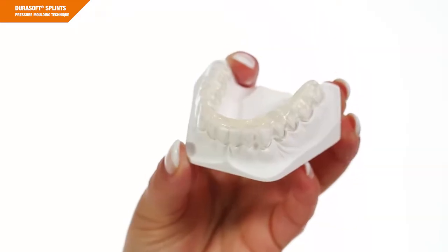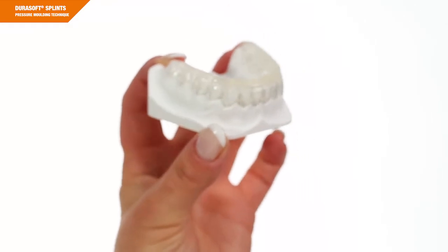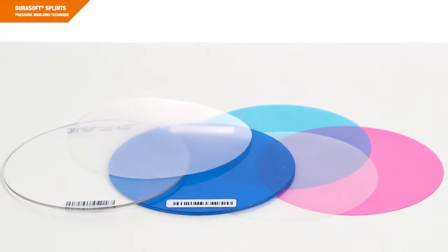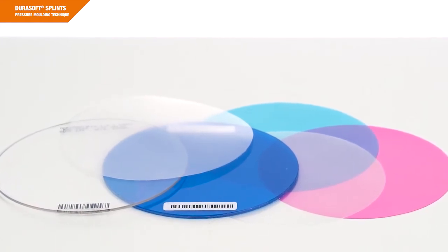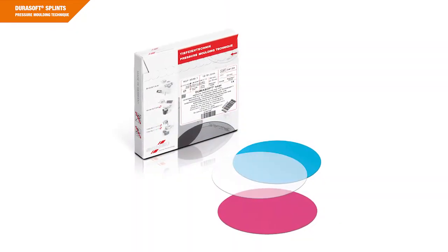My name is Peter Stigrad from Scheu Dental Company, and I'd like to guide you through this video training on the fabrication of an occlusal splint using DuraSoft material. This training is aimed at all those who want to fabricate their splints in their own laboratory. We are using products of the material family DuraSoft, a high-quality thermoforming material fabricated in a specific extrusion process.